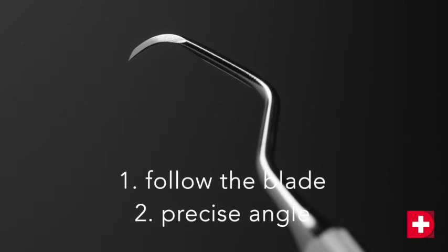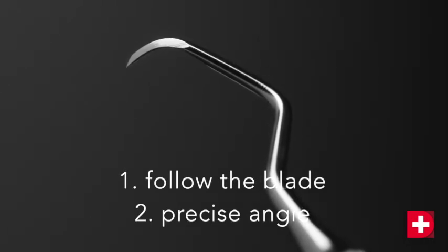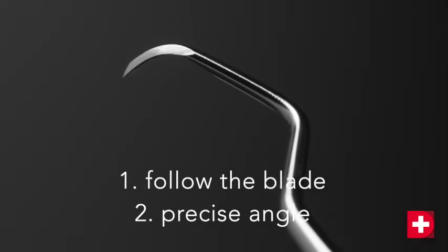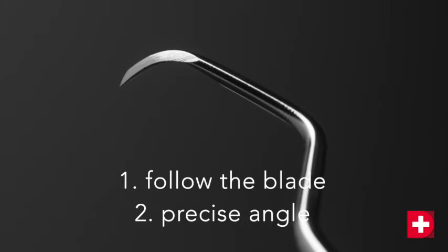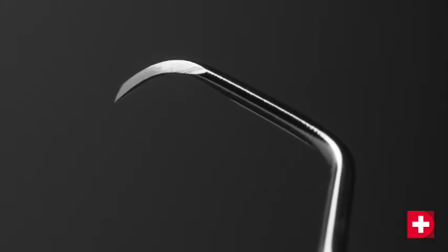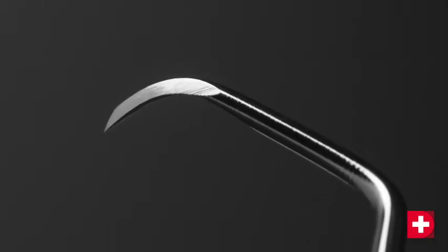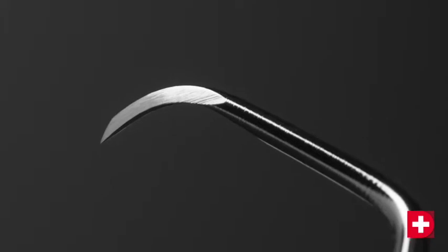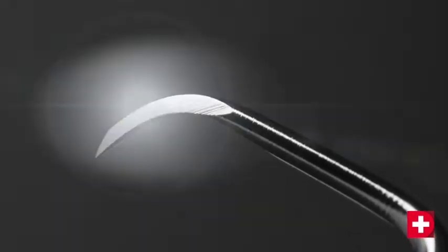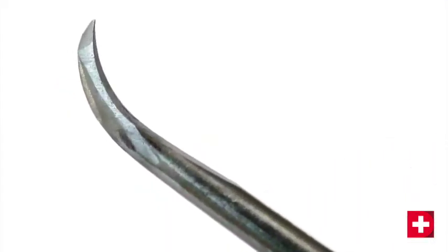The Debelin method relies on two key elements. One, the sharpening follows the structure of the steel and the curve of the blade. And two, maintaining a precise angle. Steel has a structure similar to that of wood. It is important to respect this structure and therefore sharpen by following it. You will then create a smoother surface condition and plane the blade's cutting edge. The cutting edge lasts longer thanks to this method.